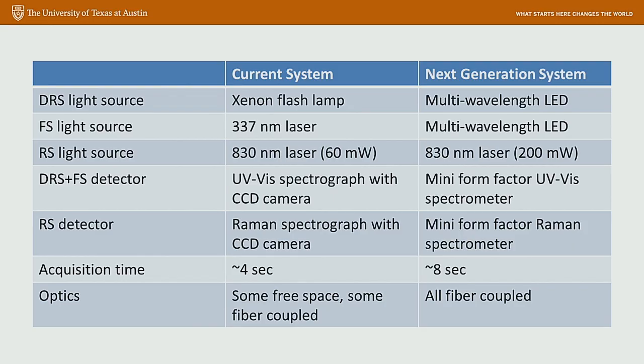One trade-off that we may have to make in choosing these new components is a slightly longer integration time, which is mainly due to the longer integration required for fluorescence collection. However, I think we can mitigate this trade-off by the fact that the optics in the new system are completely fiber coupled, which is an important consideration for a system that's meant to be used in a clinical application.